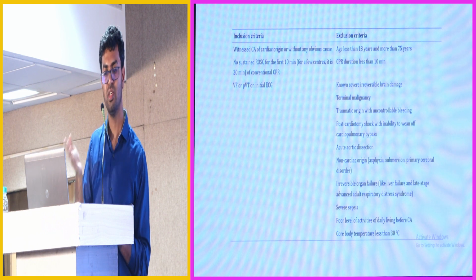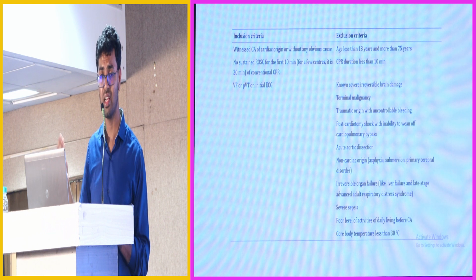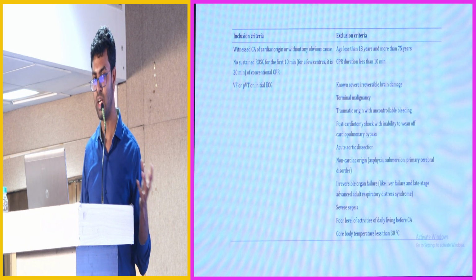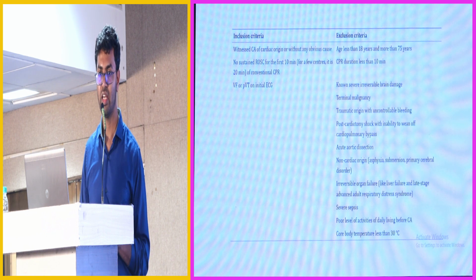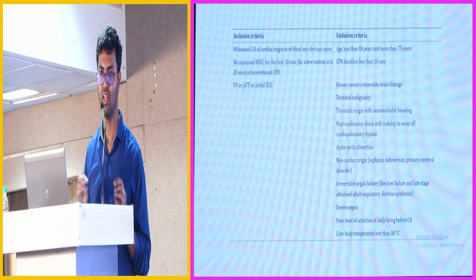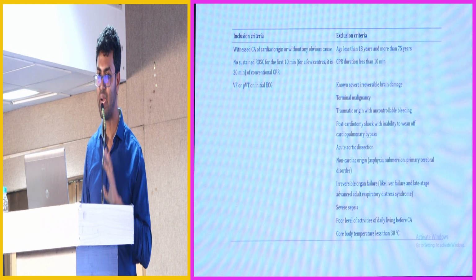So we brought the patient to the cath lab immediately. We thought it was a coronary event. The ECMO is running, she is on inotropes, and I placed the TEE. The heart is not moving at all, and they did a coronary angiography, which showed absolutely normal coronaries, no coronary involvement at all. So we shifted her back to the ICU.